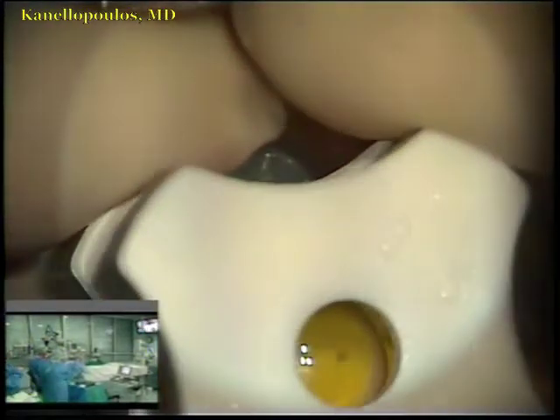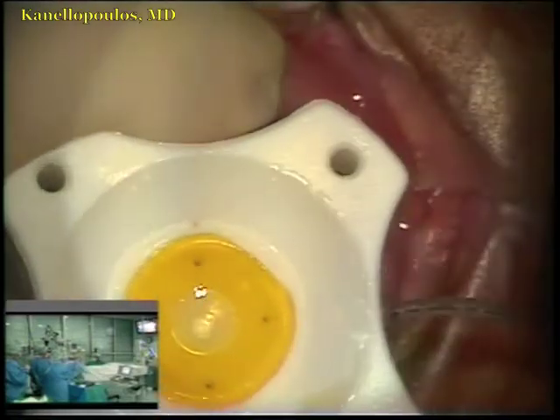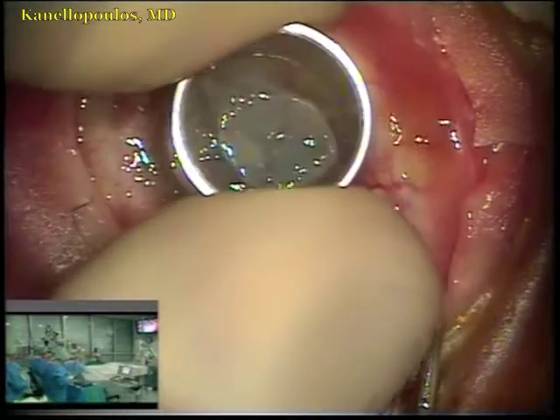We will trephine 9.5 millimeters on the donor cornea and prosthesis together. See it here — trephine.